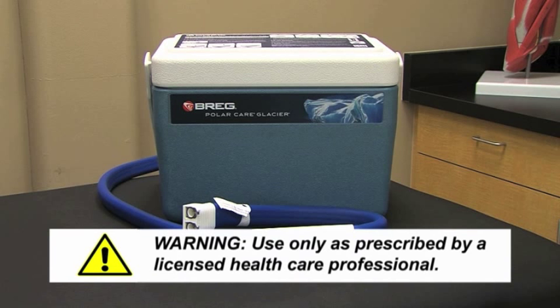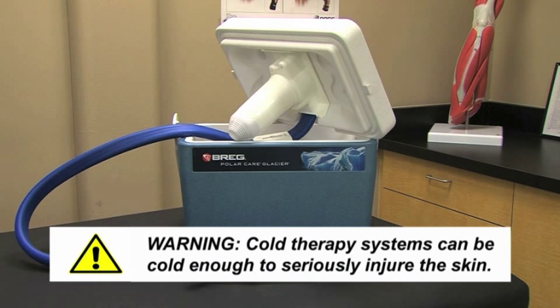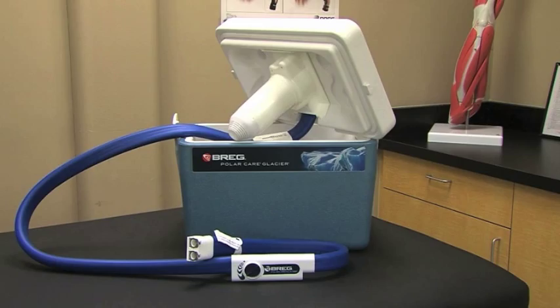Be sure to use the PolarCare system as prescribed by a licensed healthcare professional, including how often and how long to apply and when to take breaks from cold therapy. While there are many benefits to the use of cold therapy, a word of caution: cold therapy systems can be cold enough to seriously injure the skin, so be sure to follow these instructions carefully.